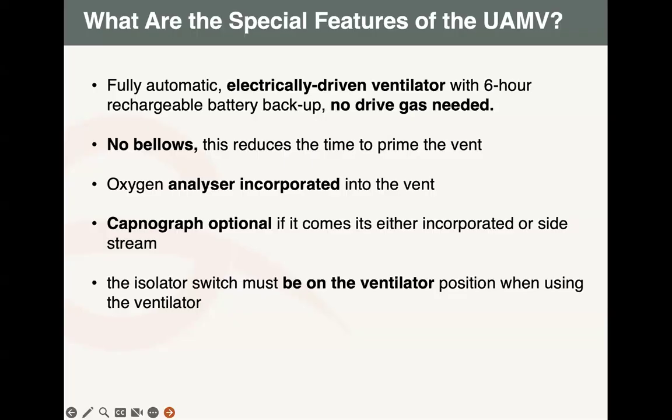And then everyone would like to know how much carbon dioxide my patient is releasing every time that they're exhaling. So that is why we are encouraging, if you want to purchase a UMV, it's better you go for the UMV that has a capnograph incorporated in it.